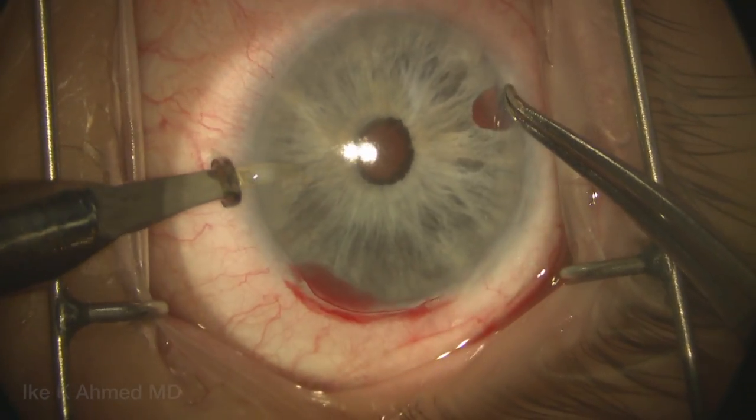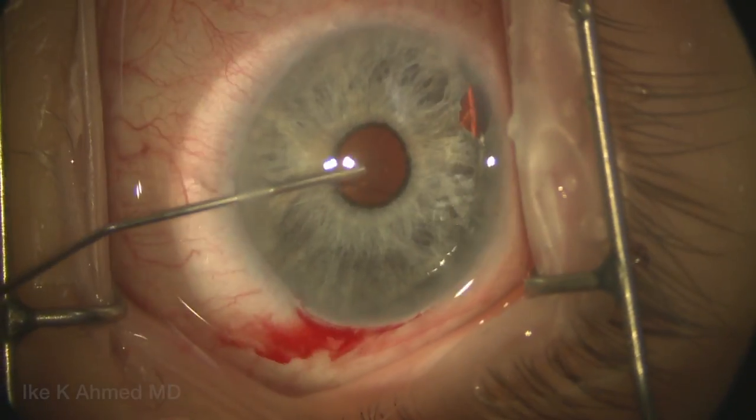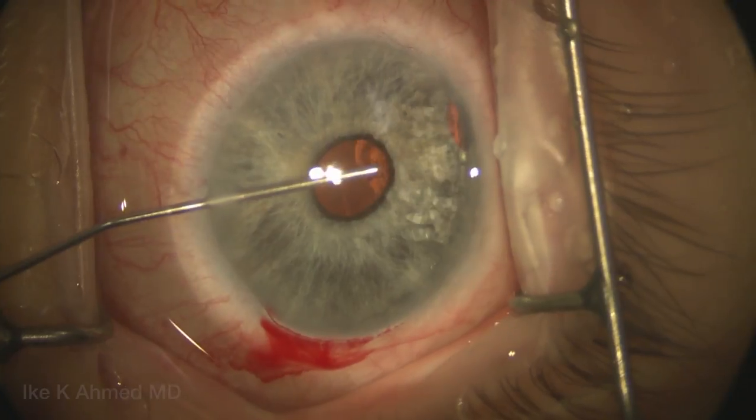Two 1mm incisions are made here, 45 degrees away from the main incision. We'll then inject some lidocaine into the anterior chamber, followed by a dispersive and a cohesive viscoelastic.